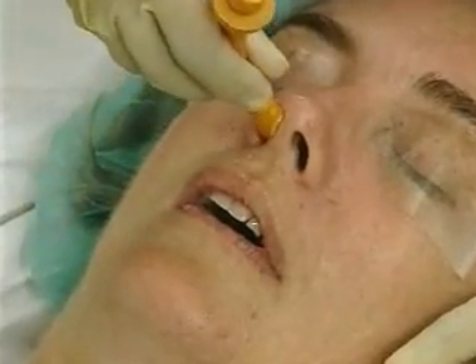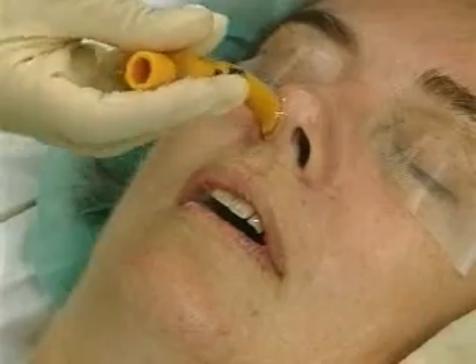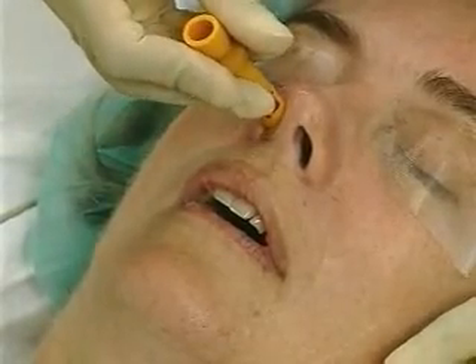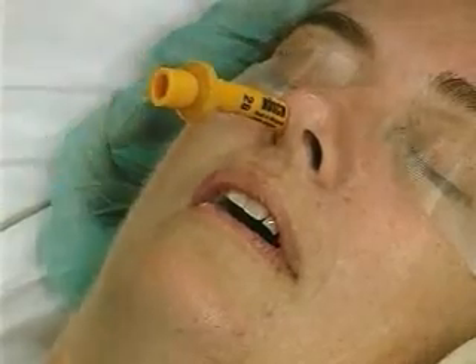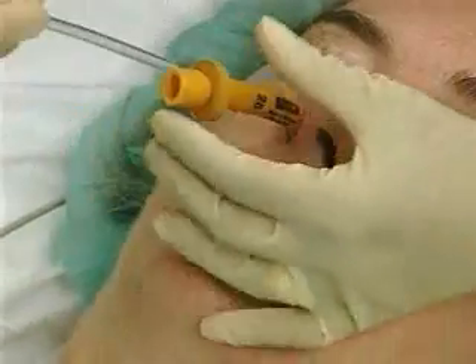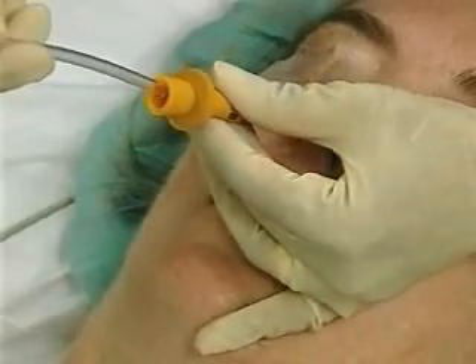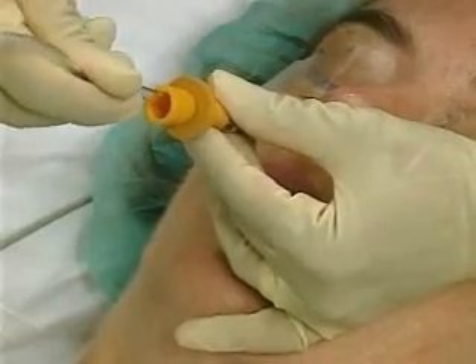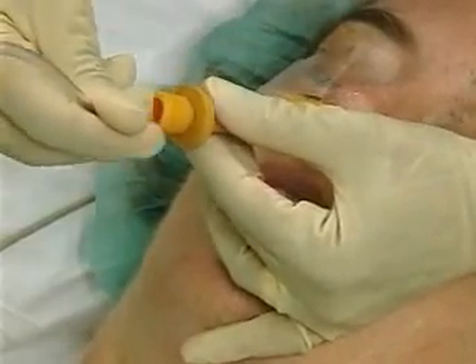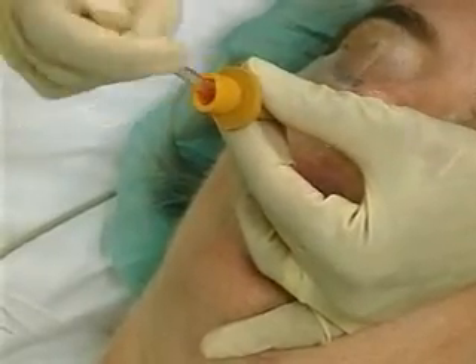If the airway will not pass with moderate pressure, it may be helpful to rotate the airway 90 degrees counterclockwise and then rotate it back to the original position as it makes the bend down the pharynx. If the airway still does not pass, a narrower tube should be used. Once inserted, withdraw the tube two centimeters and pass a small suction catheter through it, pushing the airway forward using the catheter as a guide. If still unsuccessful, the nares can be redilated or the other nare can be prepared.